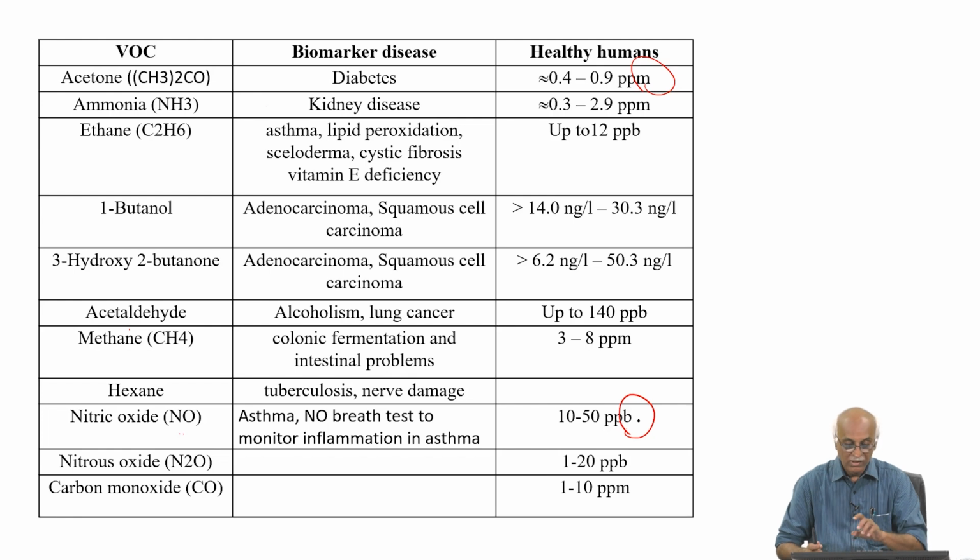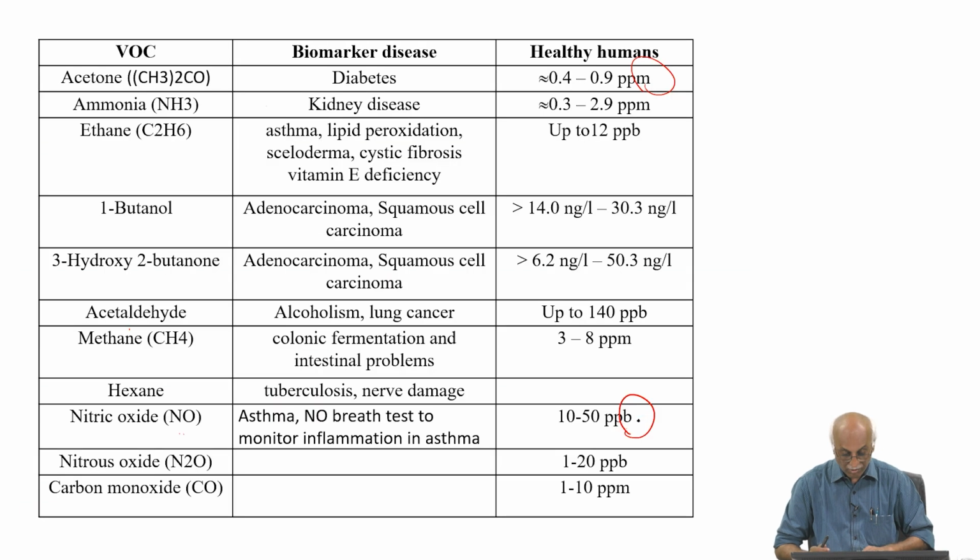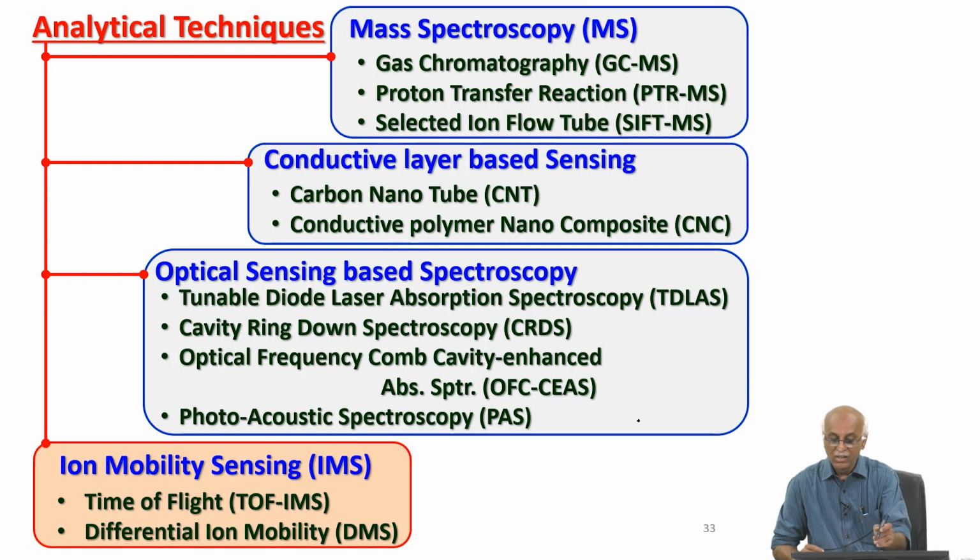How to capture it is the question. For this purpose we have various other techniques present, such as you can capture the human breath, take it to a mass spectrometer or do gas chromatography analysis, and estimate the presence of such gases.